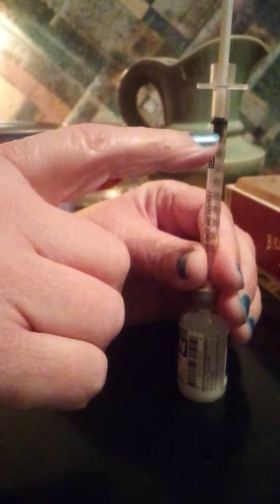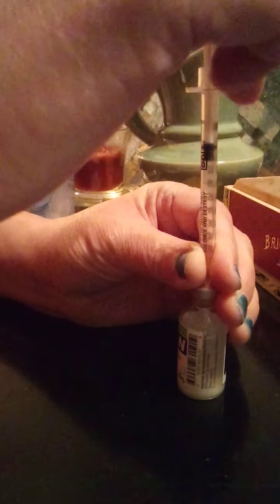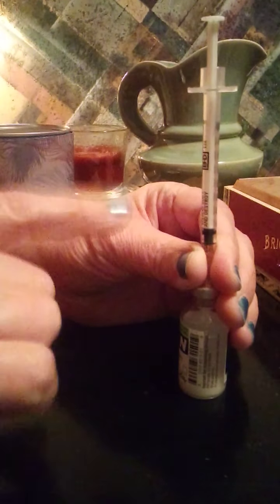So I push that straight in, and I've pulled my plunger out, almost out to the point of where I need it, because for the amount of units I'm doing, 100. That's one of the problems you get into when you're taking more than 100 units of insulin a day, or in one setting, because you have to pull it all the way out. And see, this plunger wants to be sucked back in from the lack of air, because I had difficulty pulling.